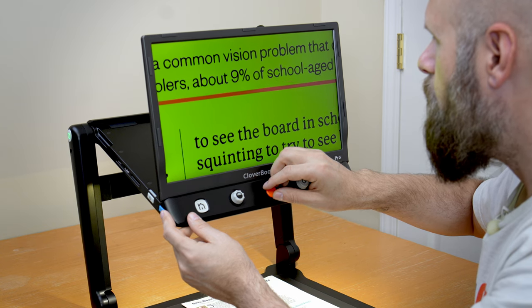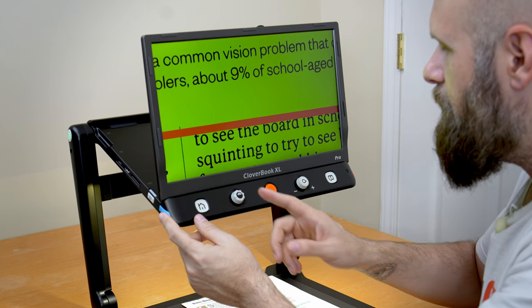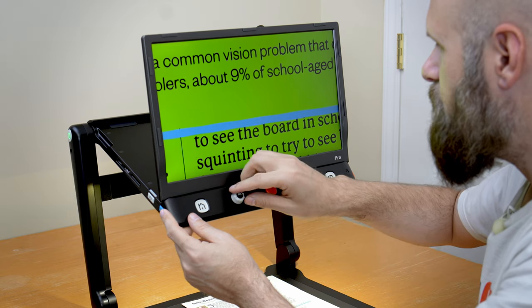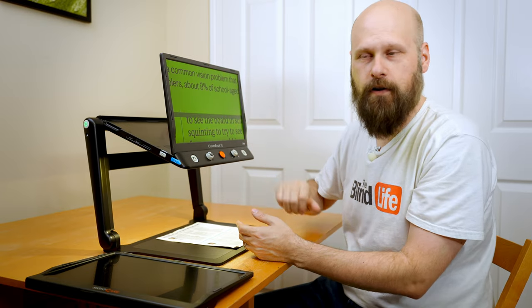I can set a line where I want it on the screen, or make it thicker or thinner. If I hold that button down and adjust the color filter, I can change the color of the line, so depending on your color filter you can find a more contrasting color for your line.